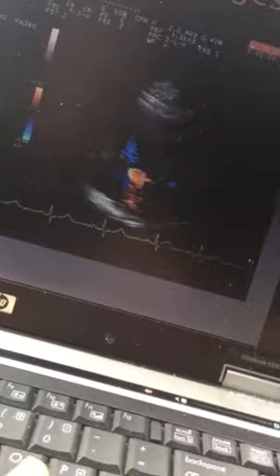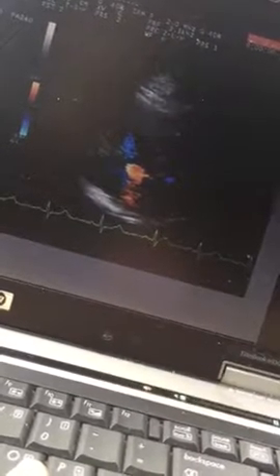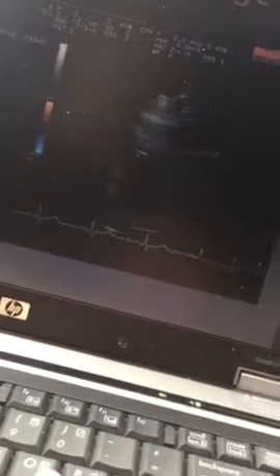Hang on here. Actually, when we go to the aorta, we can see there's no aortic insufficiency. There's no pulmonary insufficiency. The pulmonary artery velocity is 0.82 meters per second, which means our pulmonary pressure gradient is 2.7 millimeters of mercury. We can see a little trace TR.